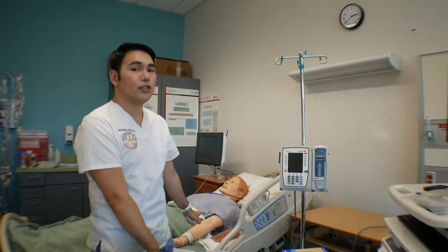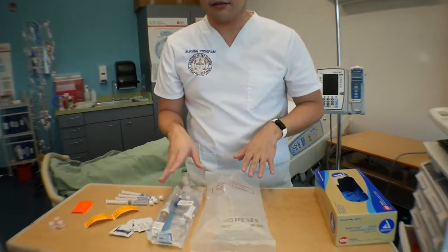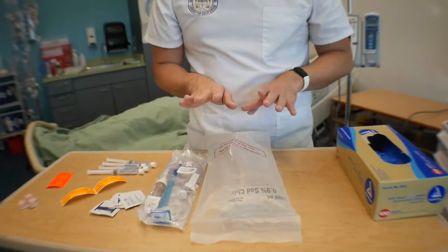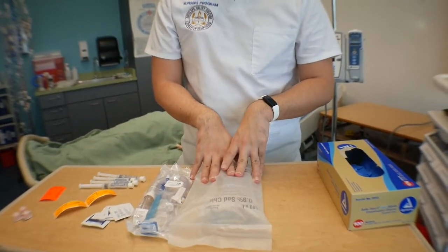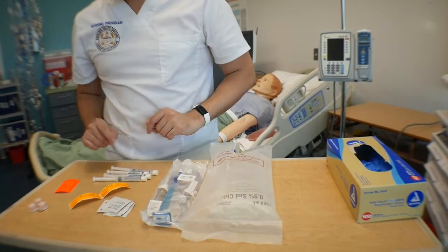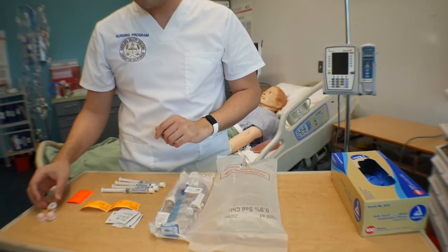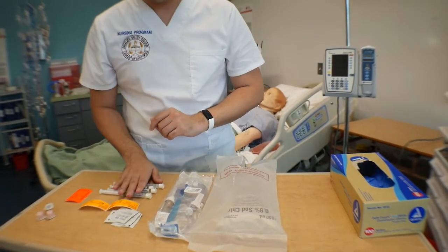Before you leave the room, make sure that the bed is down and your patient's safe. I'm going to go check the order on my computer to see if I actually have the right patient for the right order. Once I've checked that, I'm going to select the supplies that I need. For this, I have a primary tubing, the ordered primary bag, which is normal saline, 1,000 milliliters, alcohol pads, labels for my tube and for my bag, alcohol caps, and flush.